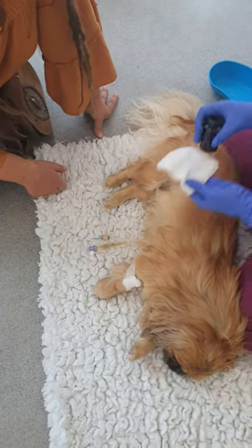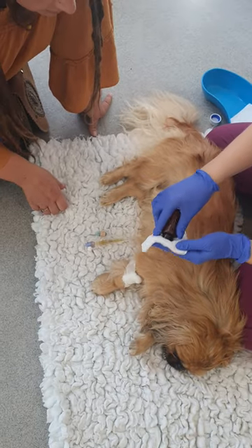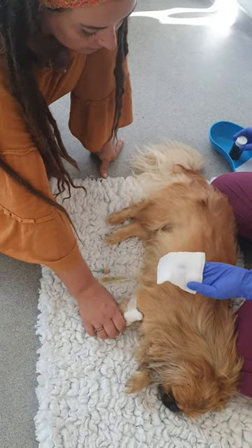If you get a bit of cotton wool or something like that at home, it would be absolutely fine. But just, I've popped a little bit of surgical spirit in there, and just to clean it, we'll pop that.